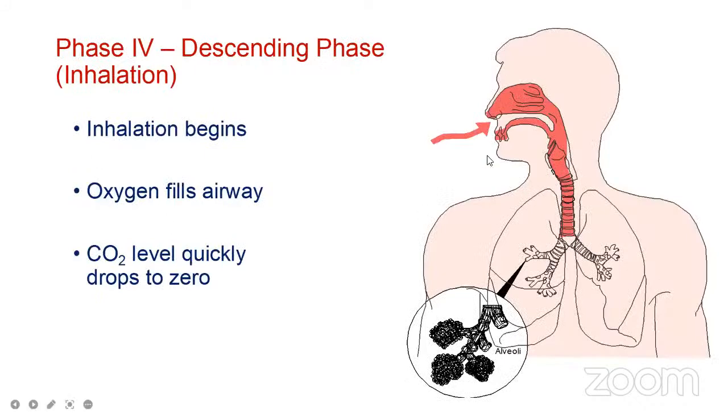And phase 4 is the descending phase, which is inhalation, which suggests the inhalation has begun and the oxygen fills the airway. So the carbon dioxide level drops to 0.